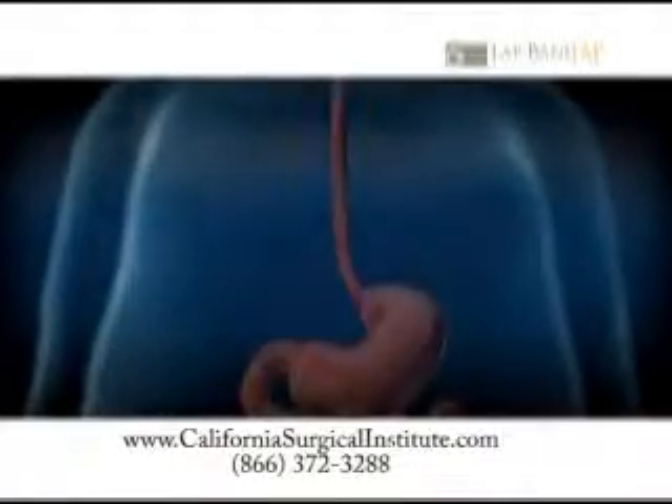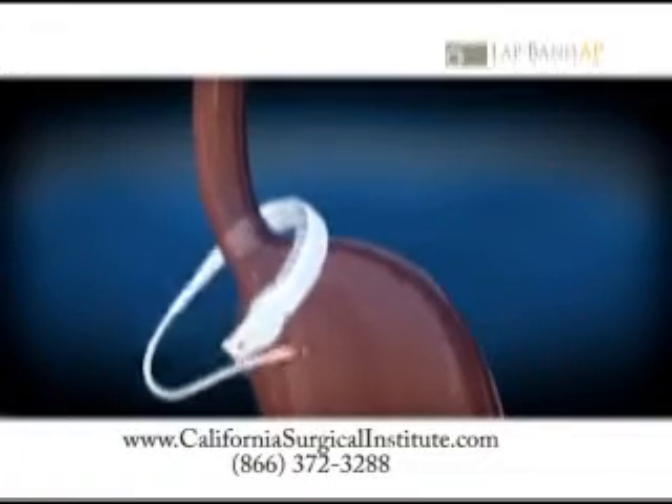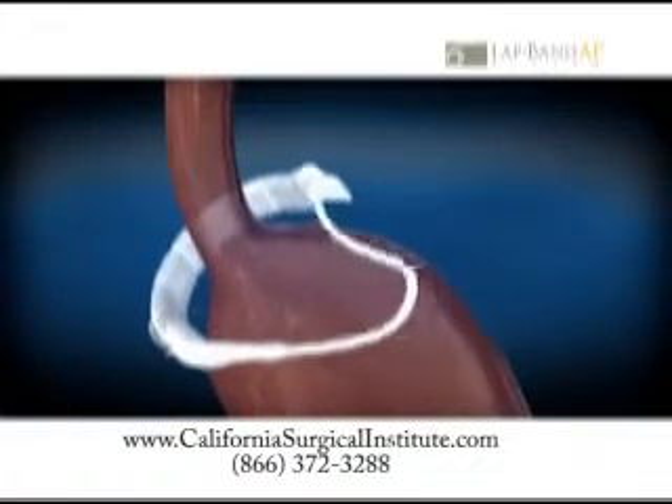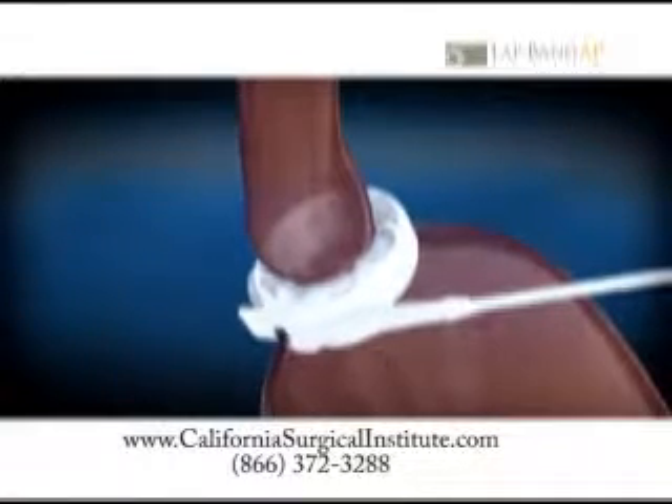The LapBand AP is placed around the upper part of the stomach, often during a laparoscopic outpatient procedure. The placement creates a smaller upper stomach pouch and a narrowed outlet between the new upper pouch and lower stomach.